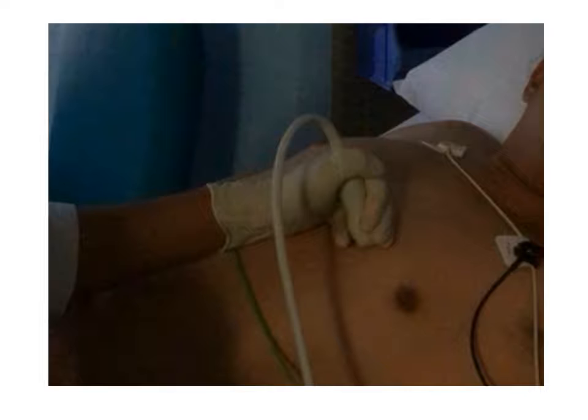This would frequently mean that you have to raise the height of the bed, depending on your own height, of course. But you should have the hand, the wrist, and the elbow all in sort of one line, as in your elbow and wrist should be at the same level, and your elbow should be very perpendicular to your shoulder. This will keep you comfortable and the patient comfortable too.